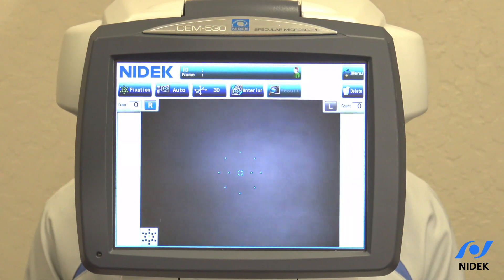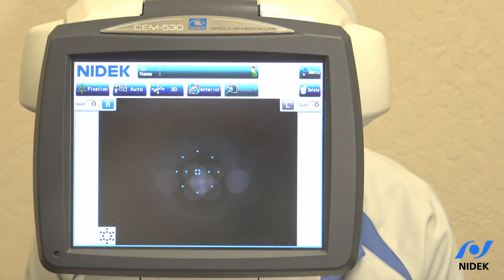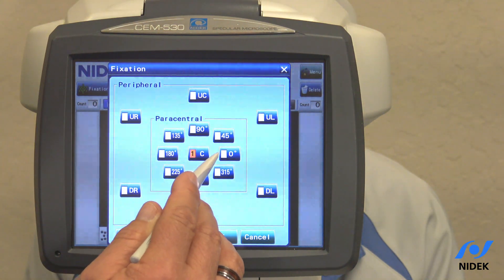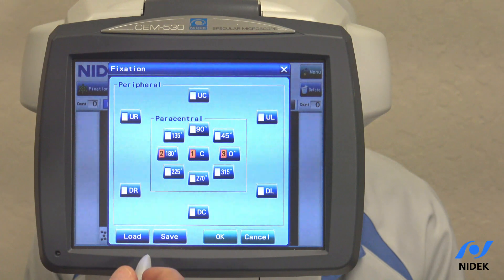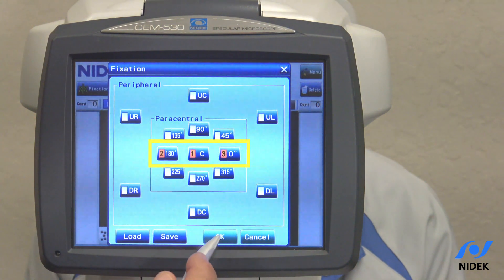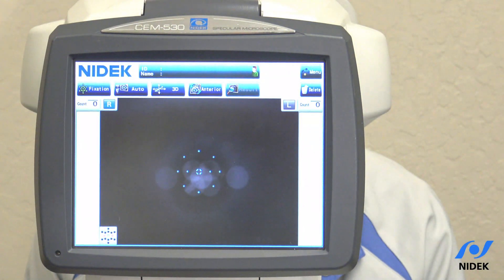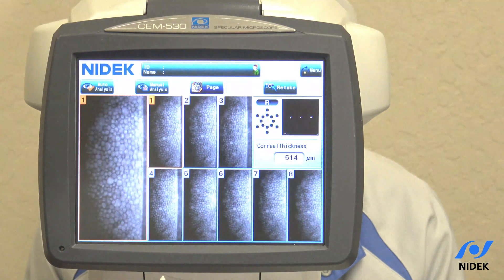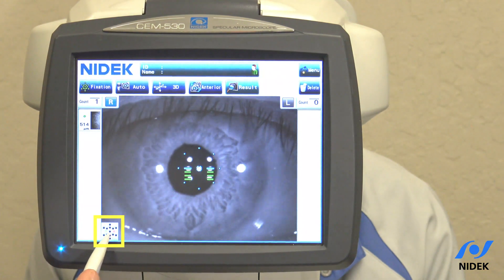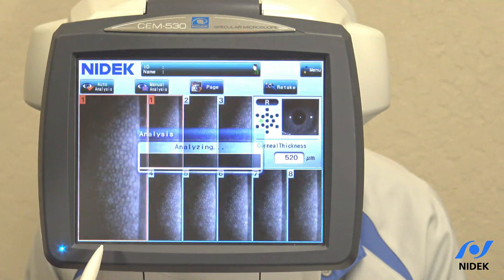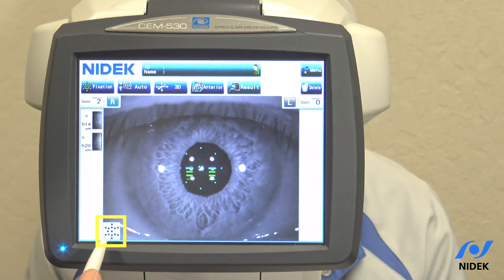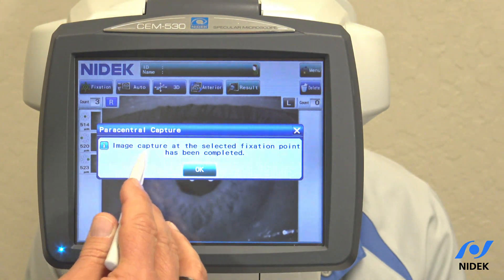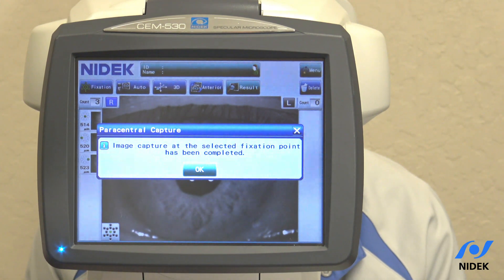Now that we've placed the patient's chin in the chin rest and have proper alignment, we're going to start by capturing the right eye. I'm going to go into my fixation settings and select the area I'd like to capture — one central and two paracentral. After selecting OK, we move the specular microscope toward the patient. Green lines appear and it will automatically start pulling the device in. We've taken the center, and the pink indicates the next area of capture. At the end, it will confirm that the image capture at the selected fixation point has been completed.